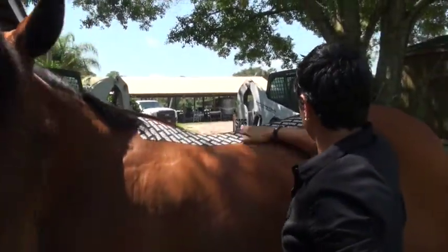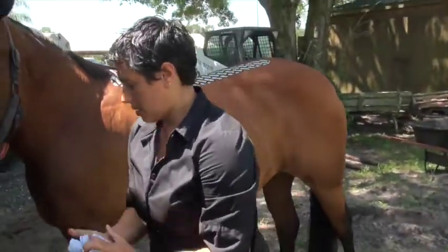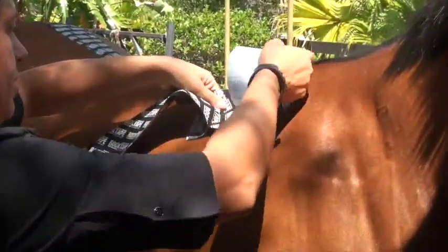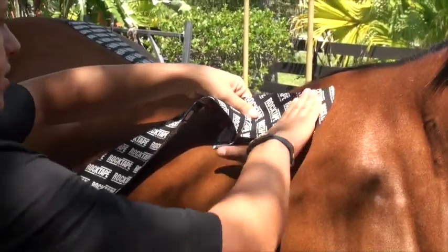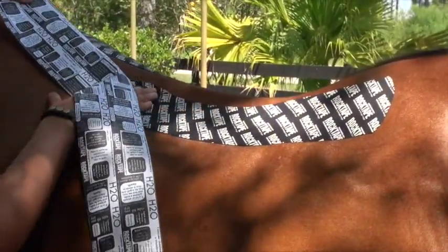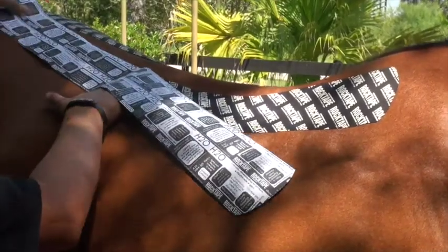I'm going to rub that down really good to activate the glue. And then I'm going to go ahead and place them down on the other side as well. I want to make sure we get both sides and try to do it as symmetrical as possible. Go ahead, place that down and rub it down. Tape along the back. Good. Rub that down real well.